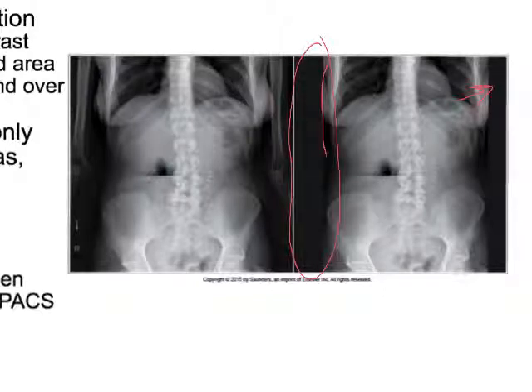They've done that in order to aid the physician with better visualizing things in the darkroom. The problem with that is once it's sent to PACS like this, even though the exposure was done like this, we've obscured diagnostic information that was on the original image. So if there was like an osteoblastic lesion or a cancer apparent on that humerus, like an incidental finding, and the radiologist doesn't have that in their report, it was in the initial image, right? Yeah, it removed their right marker. It's a good eye.